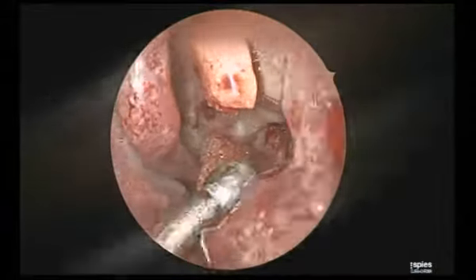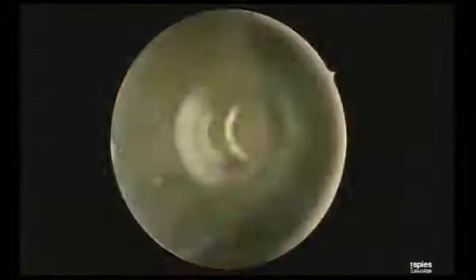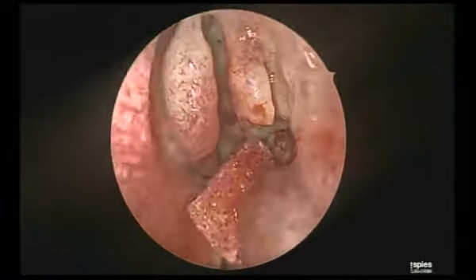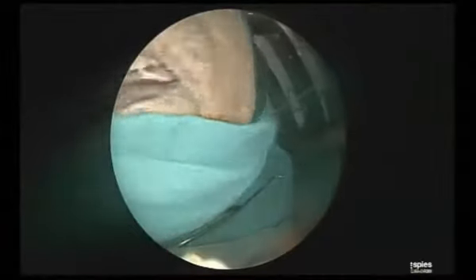At this point, Satish, if there were Haller cells, would you deal with them now, or you would remove them? Not now. But yes, I will appreciate first on the CT scan. And then I'll keep in mind to deal with that.